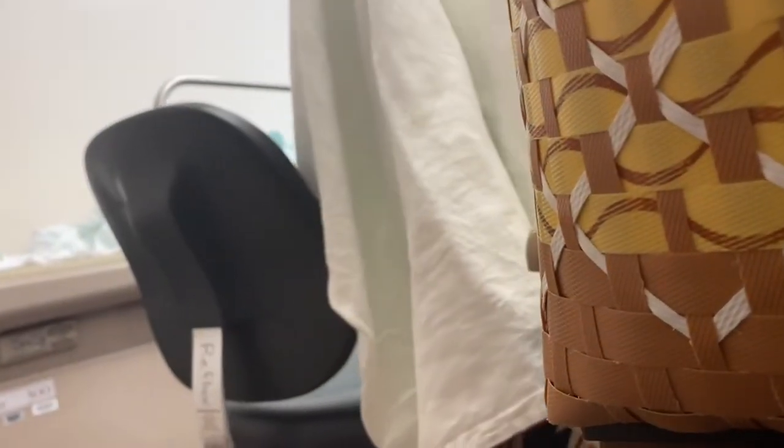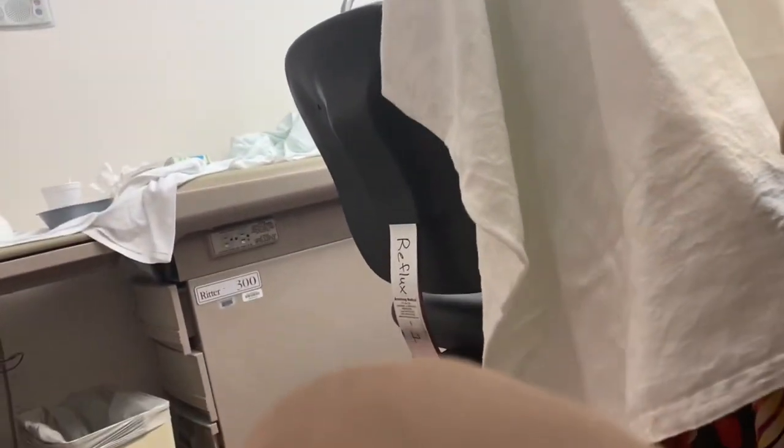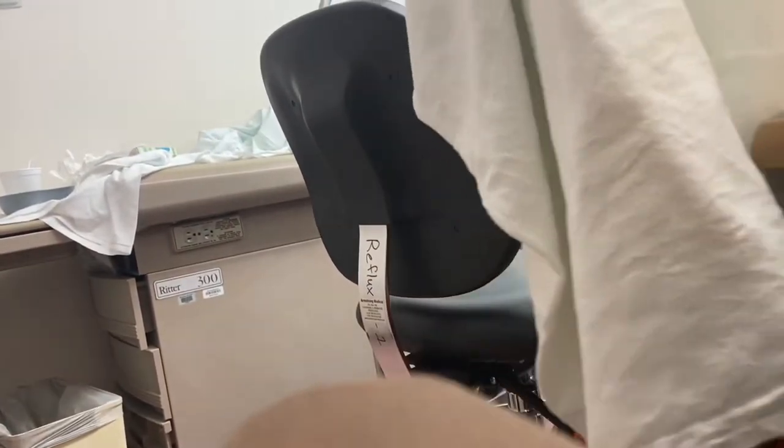Temperature. This is the time, if you knew certain things that make you have symptoms, to have them so we can try to produce the reflux. Some people know Mexican food will make them have symptoms, and spicy stuff, chocolate, mint. Let's go ahead, this is the time to do it. Knowing that, you're going to write down the symptoms and then write down when you take your medicine. All right.